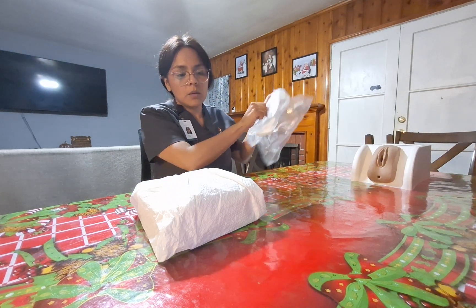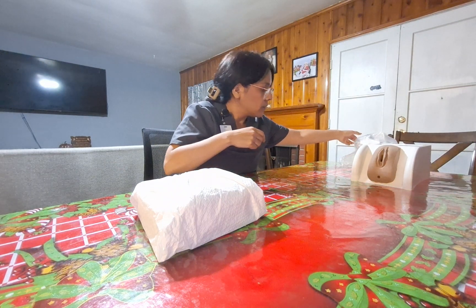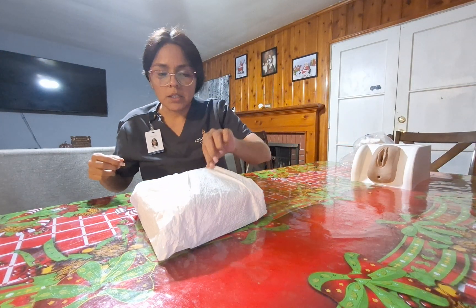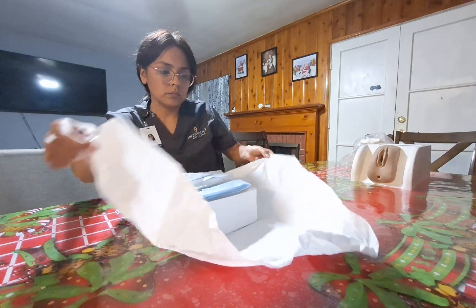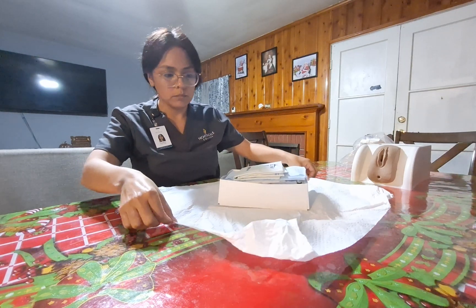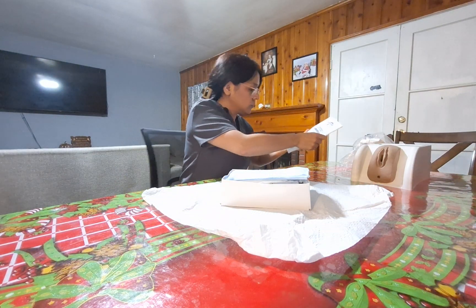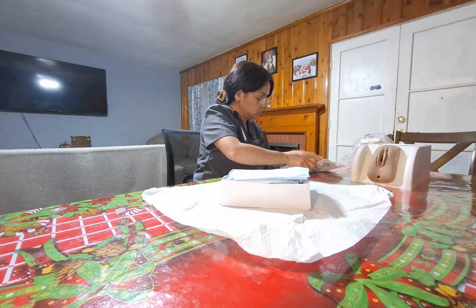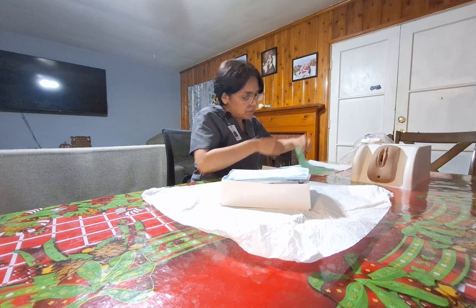I will open the kit following sterile technique, only touching the one-inch margins. I will pull out my sterile gloves and apply the sterile gloves.